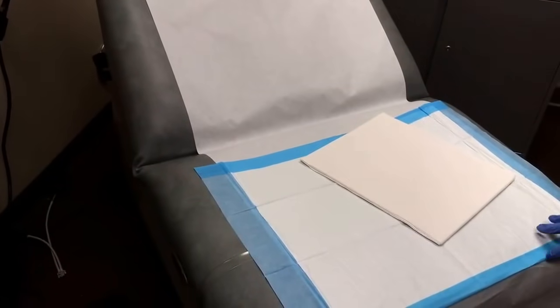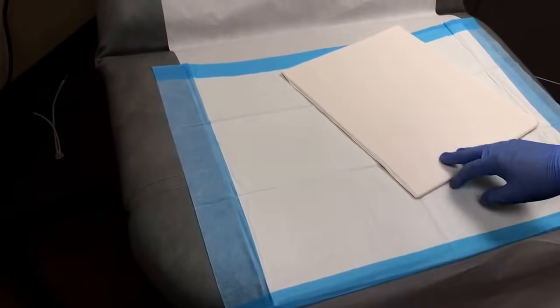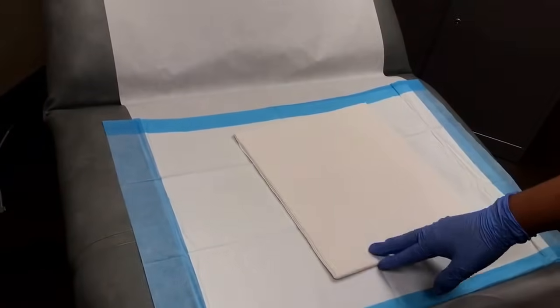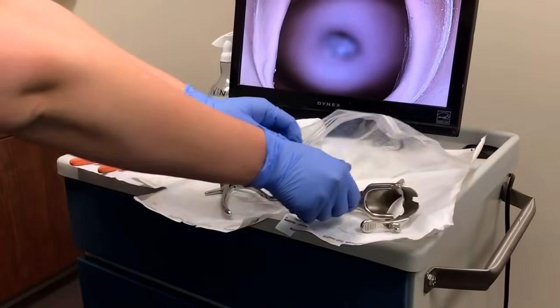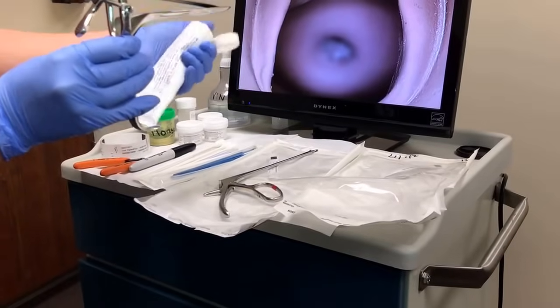Prior to the patient coming into the room, you want to make sure that you have a chux pad on the bed and also have the drape. First, the medical assistant will grab the metal speculum for the provider and add a drop of lubricant.